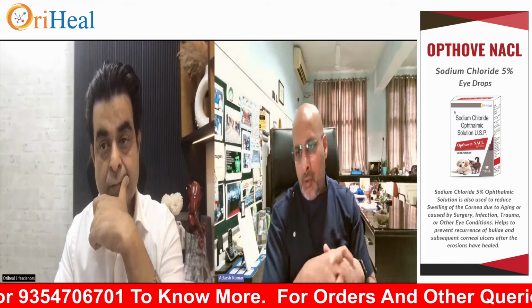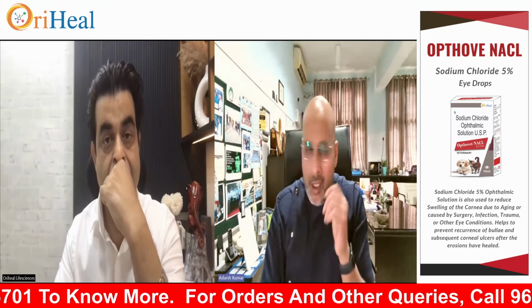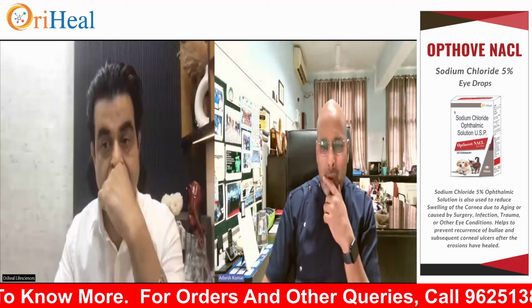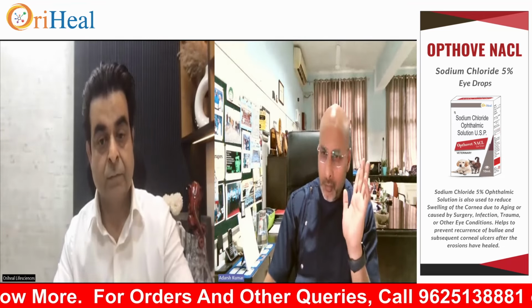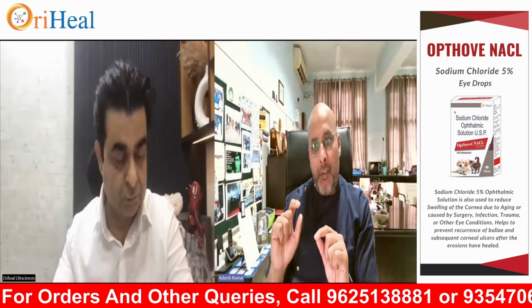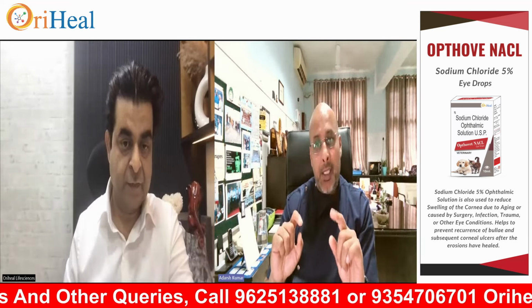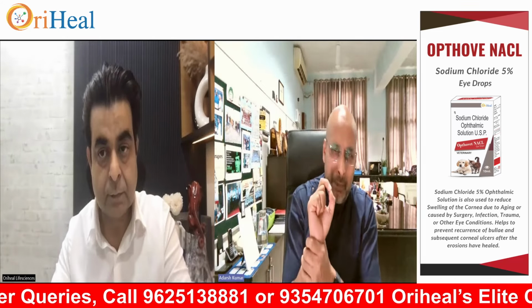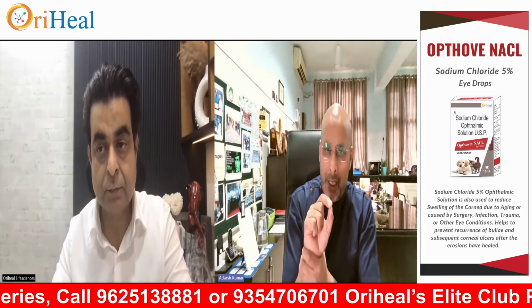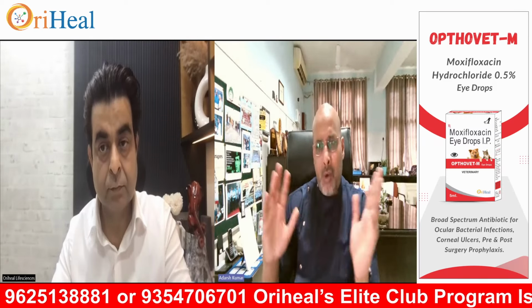Anil is asking how to manage a broken tooth during extractions. I say a broken tooth is quite a good problem. I told you, you have to dissect the alveolar. Since you have to take an X-ray, take the X-ray and see the size of the root tooth remaining. If a very small tip has remained inside, literature says it doesn't matter, it won't cause any harm.